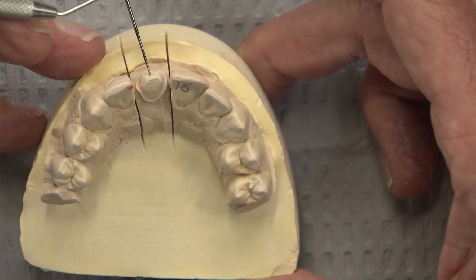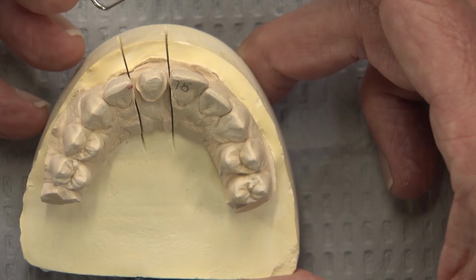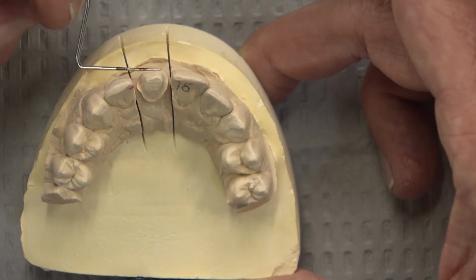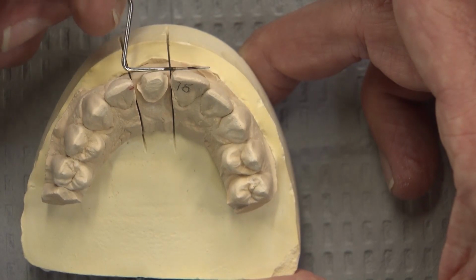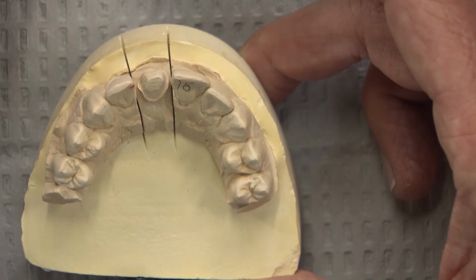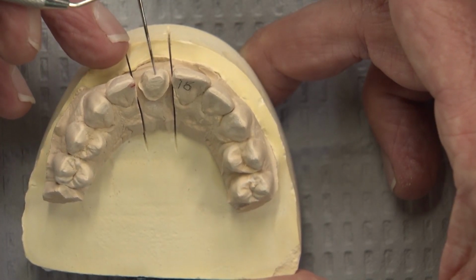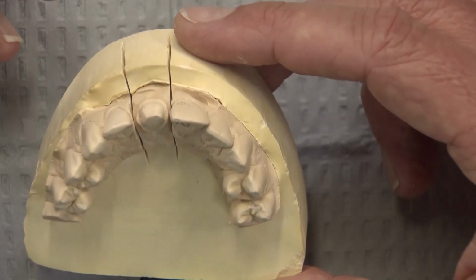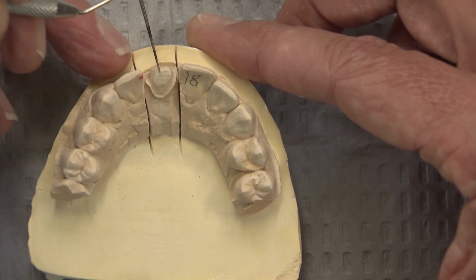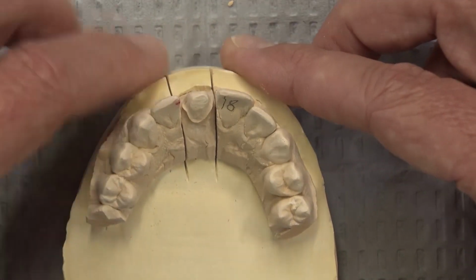This spot right here, the junction of the incisal third and the middle third, is a really easy thing to leave too bulky. A lot of times, once you get the stone model, you compare this to this and go, ooh, we may or may not have enough room here. It looks like we have enough room here. In that reverse prep technique, I put a depth cut right here at the junction of the incisal and middle third to make sure we don't get a Bucky Beaver prep. And you can see how this prep along the facial surface in the incisal half does in fact tilt back towards the lingual, which is nice.